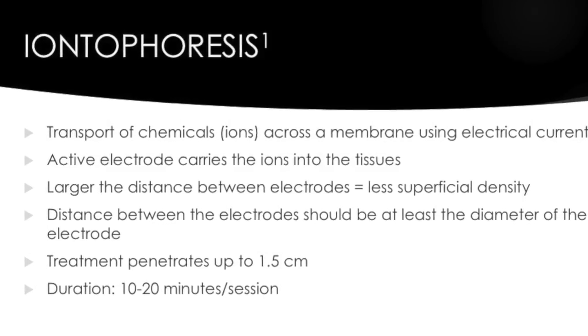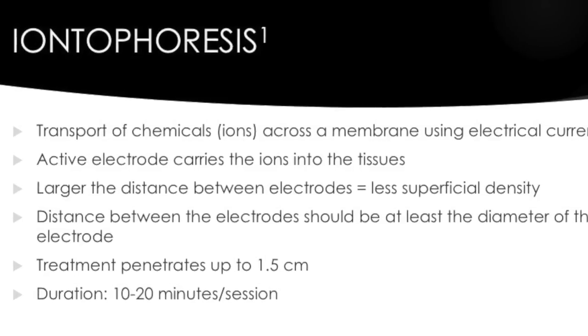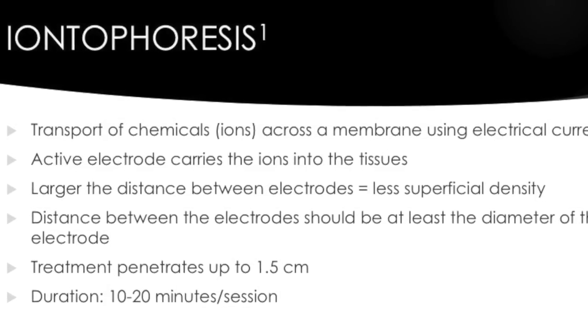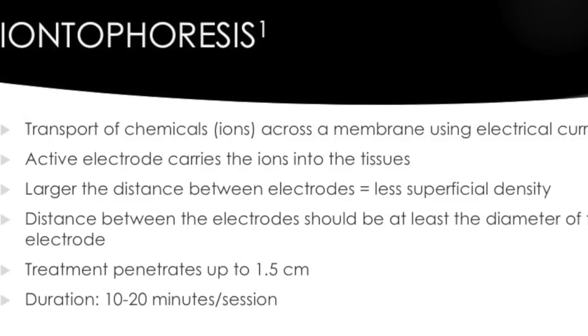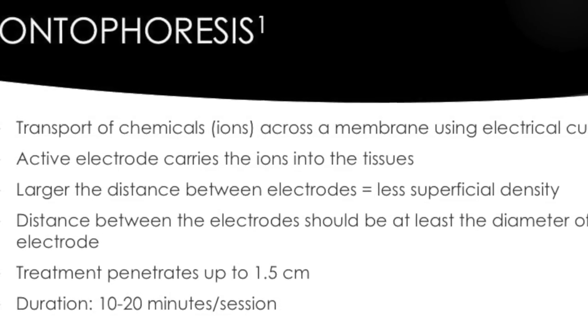One way to increase ion transfer is by increasing the intensity and duration. Treatment penetrates up to 1.5 centimeters over a 12 to 24 hour period treatment. Treatment duration is typically 10 to 20 minutes in length.